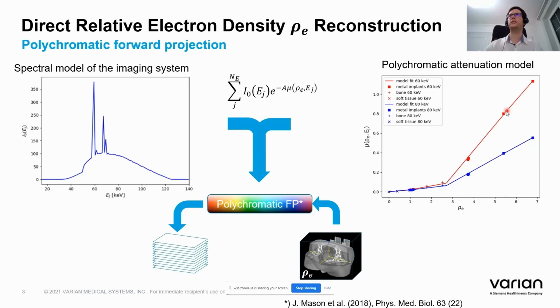If you choose one metal as a base component, you could scale its attenuation properties. So I would expect that you could select something like titanium as a base material in the Acuros model, and then represent all the others as a scaled version of titanium.